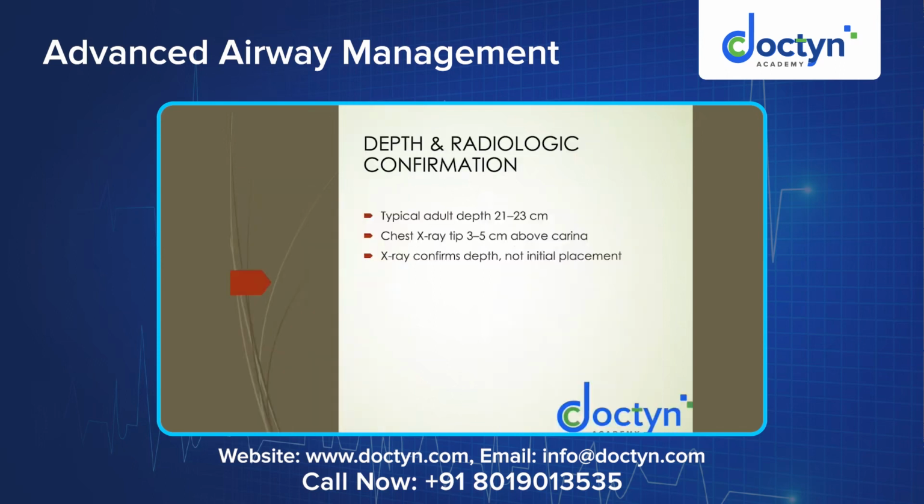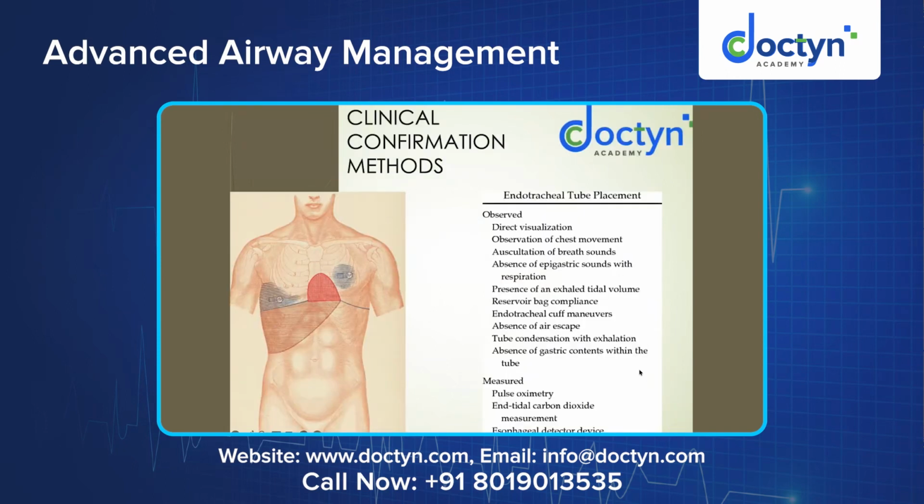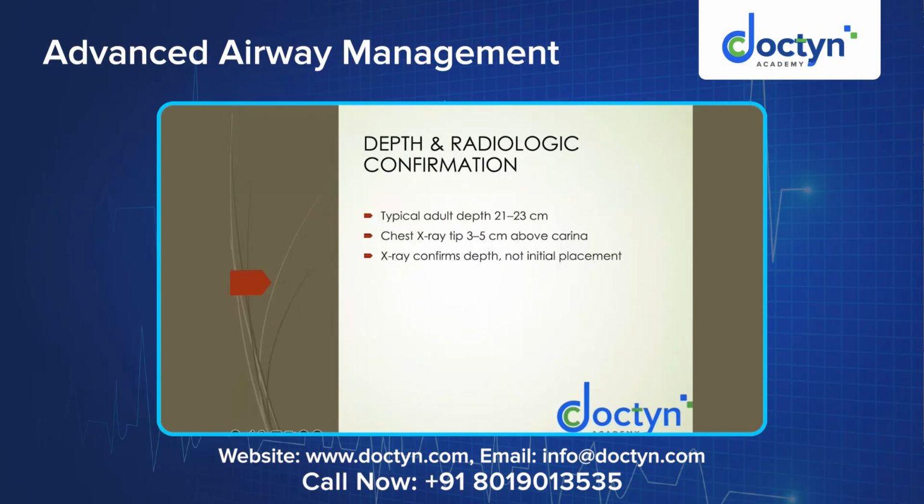So absence of air escape, condensation with exhalation, absence of gastric contents within the tube. These are many other ways to confirm the endotracheal tube placement. And how it is measured, if you want to monitor: persistent or improving pulse oximeter readings, end tidal carbon dioxide measurements. The esophageal detector device is also easily available but not used regularly.